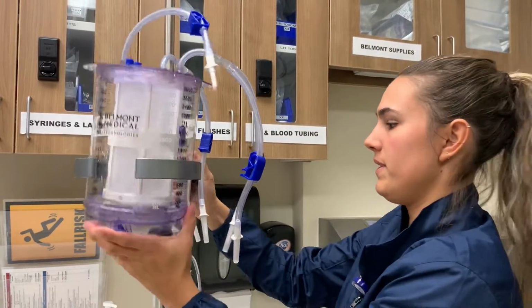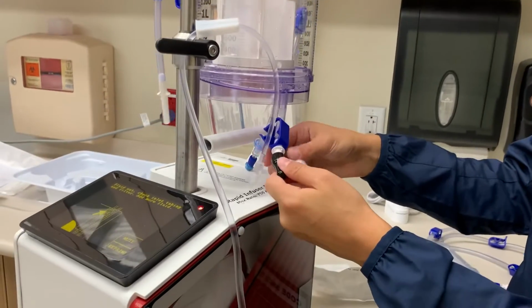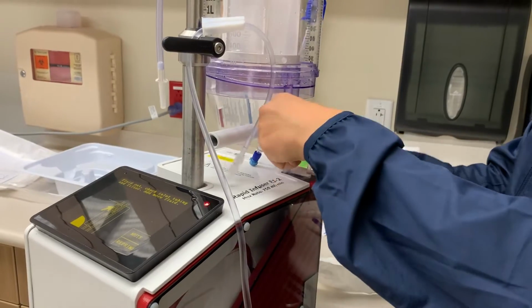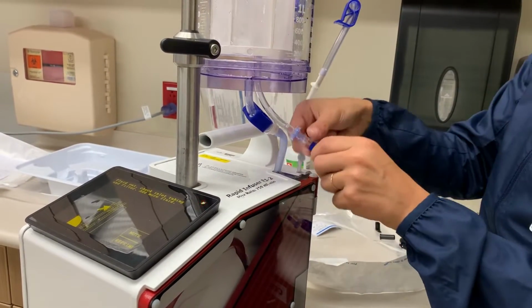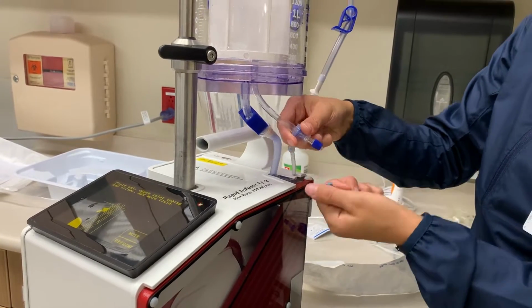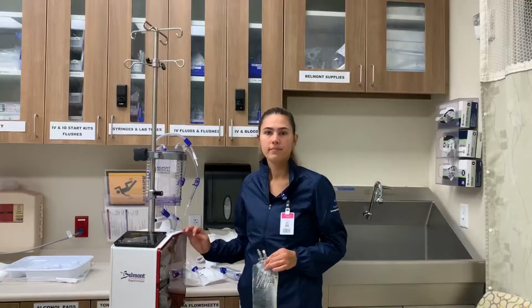And then I'm going to flip this around. So now you can connect, pull the black off of here, and you can snap that into the tubing, and then you can unscrew this cap and screw it into the tubing here on this side.